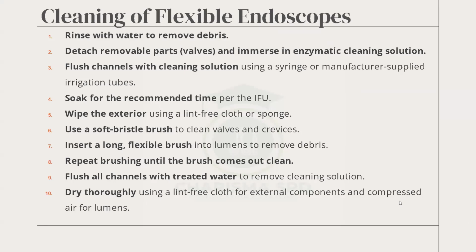So these are the cleaning processes of flexible endoscope. Rinse with water to remove debris, detach removable parts, immerse in enzymatic cleaning, all of that. Flush, okay. Wipe the exterior with lint-free cloth. We spoke about why it must be lint-free, because lint stays on, it can drop into the sterile field and then infect the patient. Use soft bristle brush, not metal.